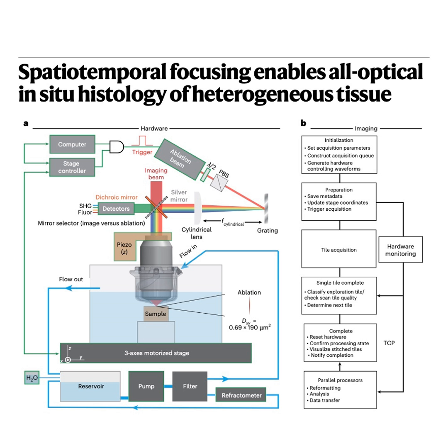Clever. But what about errors? What if the ablation isn't perfect? If it misses a tiny spot, leaves a bit of tissue behind from the layer it just tried to remove? That's a critical point, because any residual tissue, even microscopic bits left on the surface, will severely scatter light. It would ruin the quality of the scan for the next layer down and likely mess up the ablation of that next layer too. So perfect removal of the current layer is essential before moving deeper. How does it ensure that?